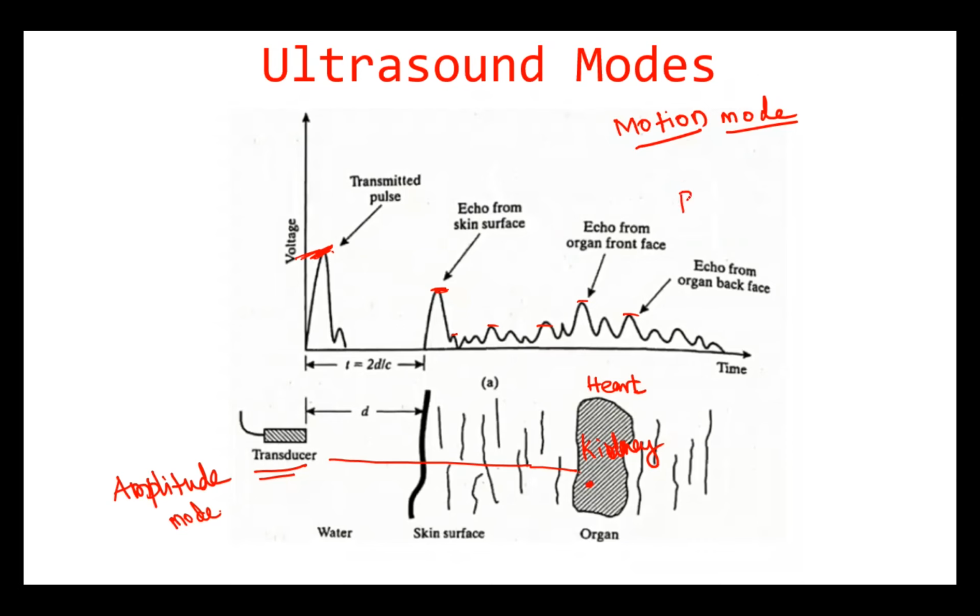Right? And we have a brightness mode. So high frequency, very high frequency waveforms are given, and by using the same amplitude mode principle, you will receive some signal back. And for high frequency, even if you give high frequency, the more sound echoes are reflected back. So that is called brightness, right? So there are 3 modes. You will study these in detail when you come across your own subjects in ultrasound, right?